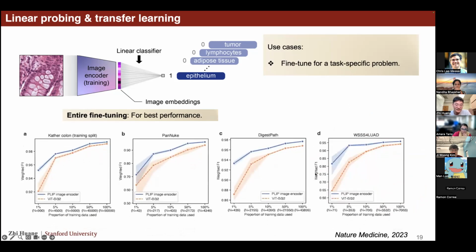And this finding is consistent across all 4 external validation datasets, right? So in other words, in the future, take an example of myself. If I want to train a classifier for pathology images, either focusing on tissue-level classification or cell-level classification, I would prefer to use PLIP as the backbone to further train on, because it will give us a higher performance, because it already knows a little bit more about pathology knowledge since it was trained on OpenPath. So that's the basic concept.